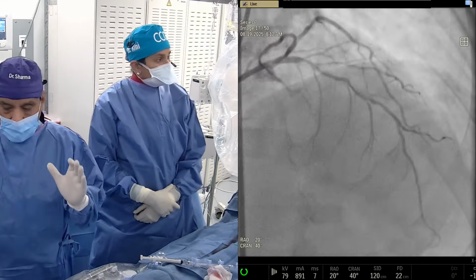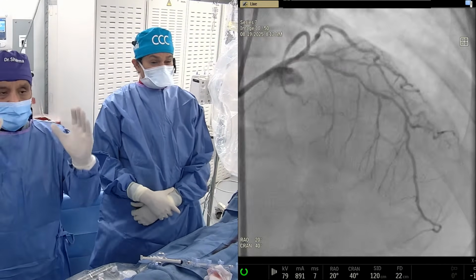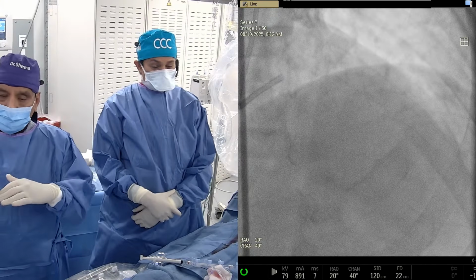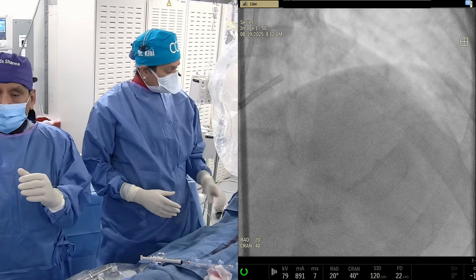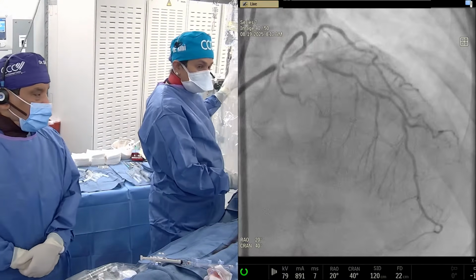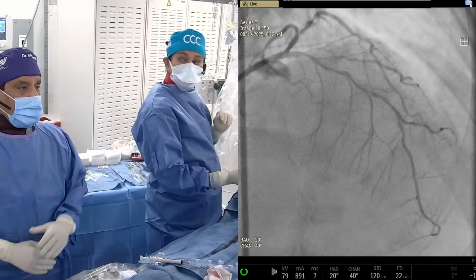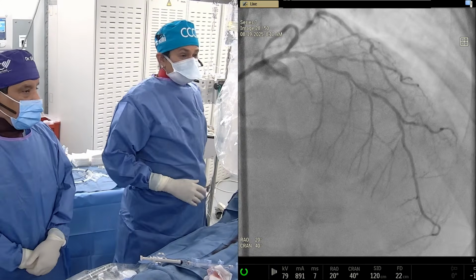So clearly, DCB is good when you have stent-like results. Residual stenosis maybe still 30-40%, not zero, but no dissection and good flow. That's where the DCB comes in. So the question is DCB instead of stent only if you have good results from your intervention.